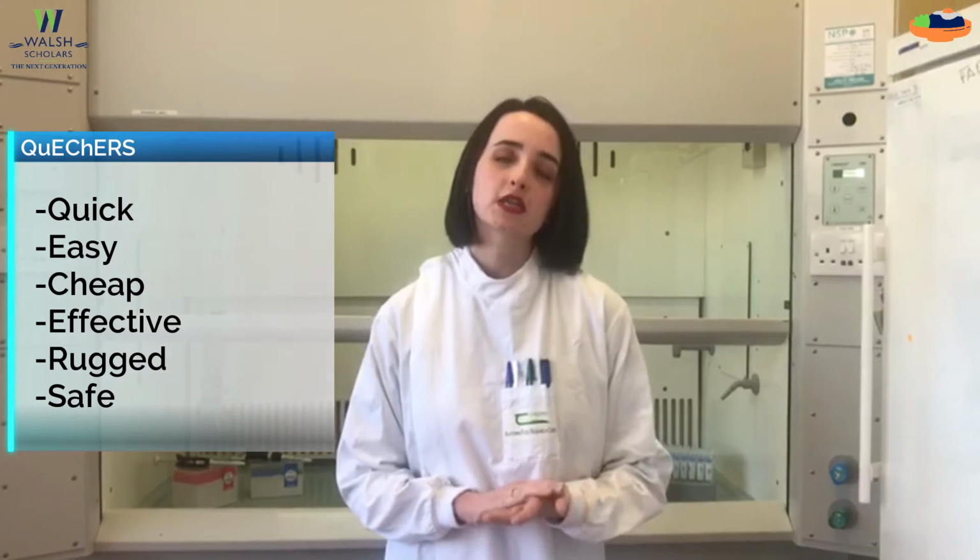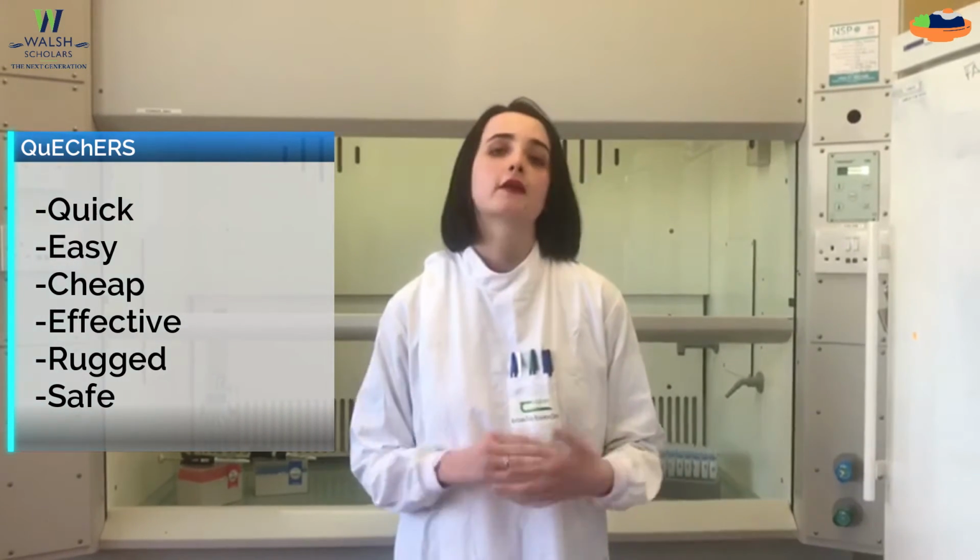I've also made changes to the extraction approach. So conventionally, the majority of methods would use a double liquid-liquid extraction, whereas now I'm using something called a QuEChERS-based approach. And QuEChERS stands for quick, easy, cheap, effective, rugged and safe, and that speaks for itself. It's just an incredibly efficient way of extracting residues out of food for detection.